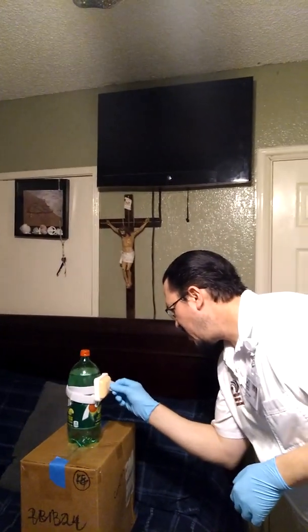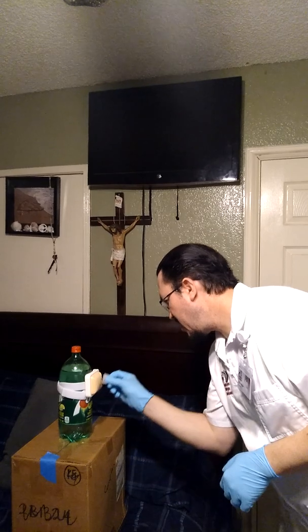Okay, so I'm gonna get the alcohol wipe. I'm gonna clean the area. Okay.